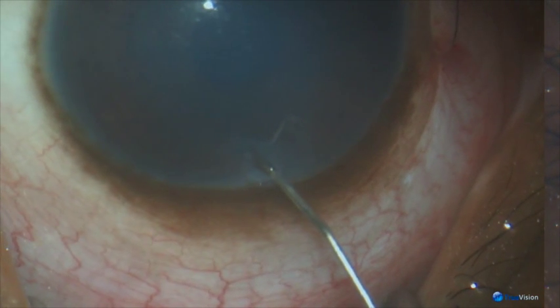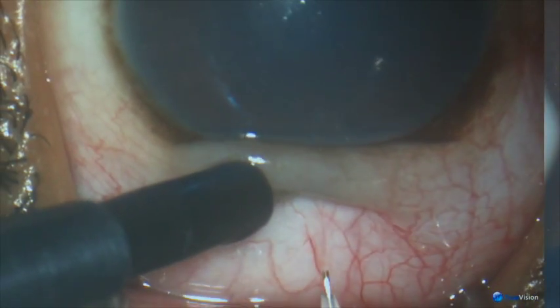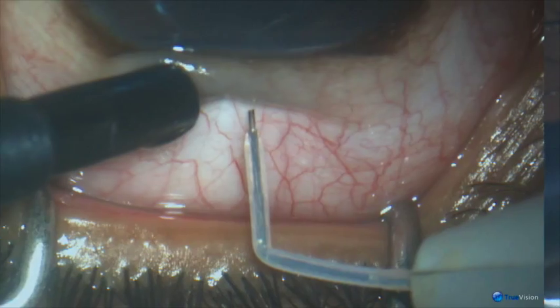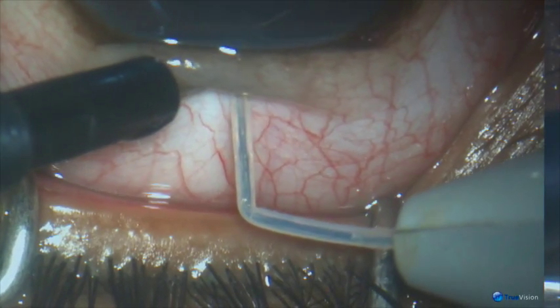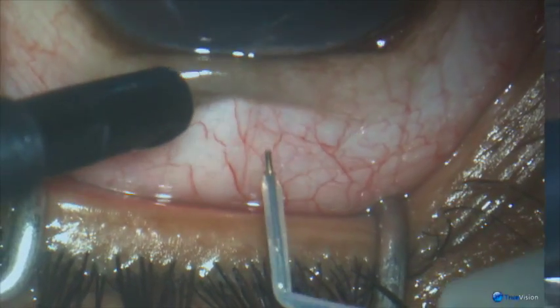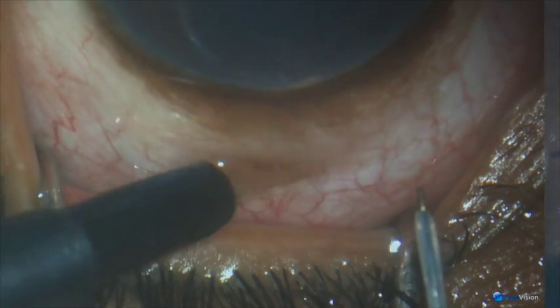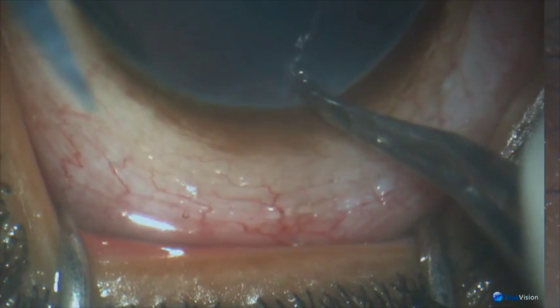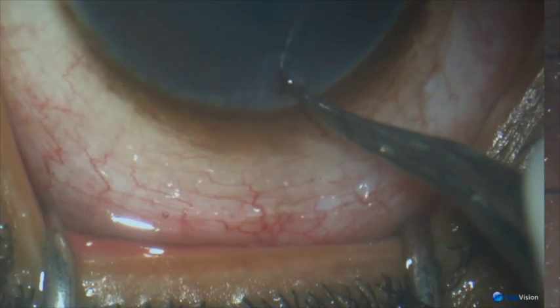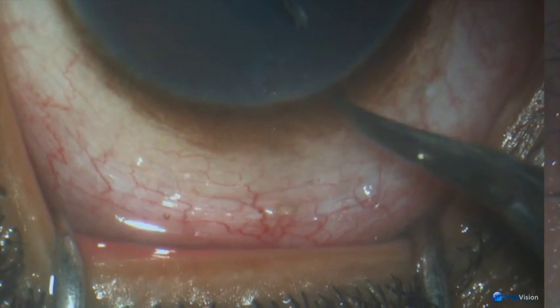Injecting sodium hyaluronate to fill the upper part of the anterior chamber. A 200-micron fugo blade tip, in line with the corneal incision, makes a track about 300 microns.